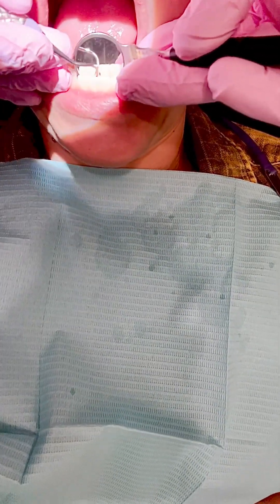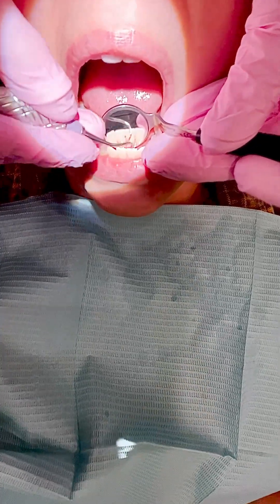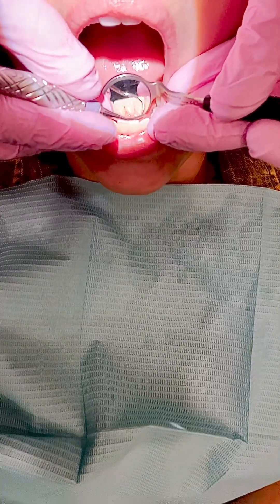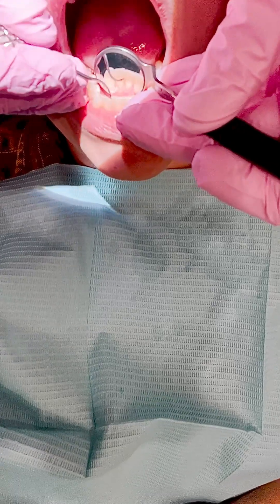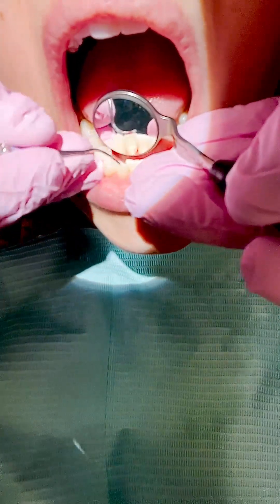Blowing air is a really good way to see the chalkiness of the teeth. Now I'm sitting at 9 o'clock and working my way to 12 o'clock. From 12 o'clock I use indirect vision and get the straights of the teeth — I work on the straights, then go interproximal. On this area, the lingual aspect is what gets a lot of buildup. The number one place you miss when cavitroning is the straight of the tooth. I'm coming up into the contacts but really getting the actual supragingival surface of the tooth.